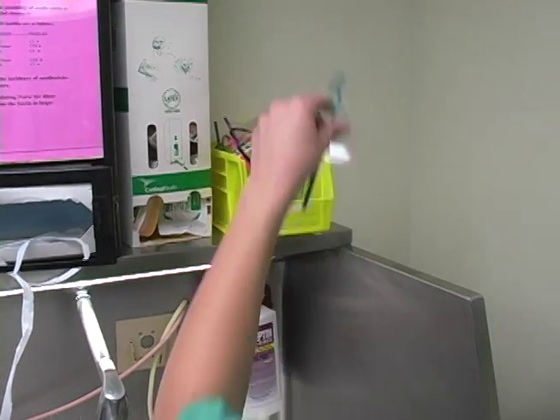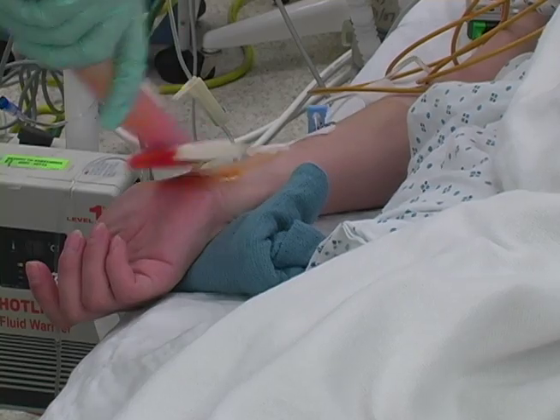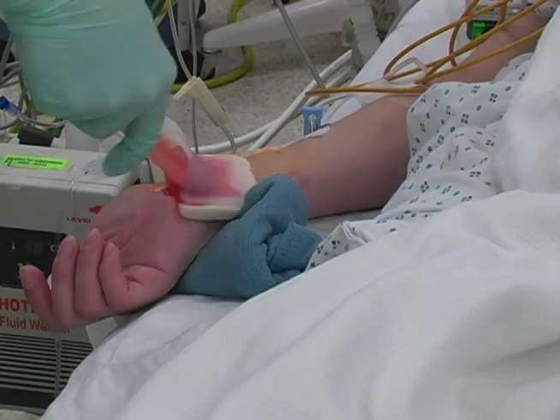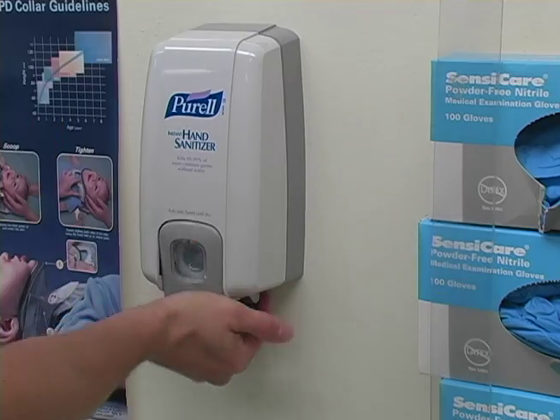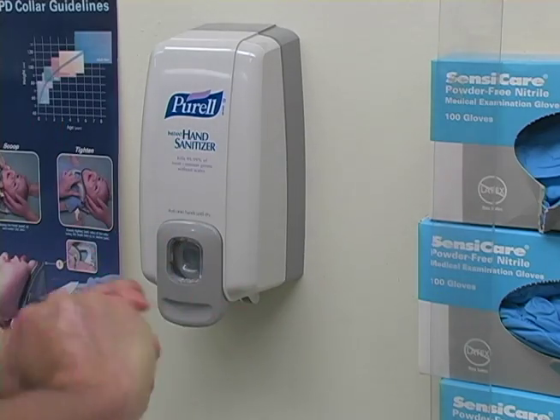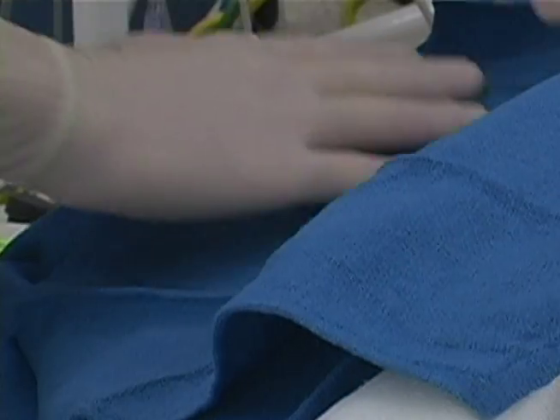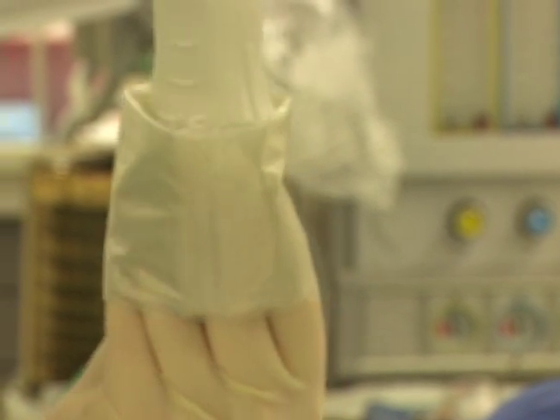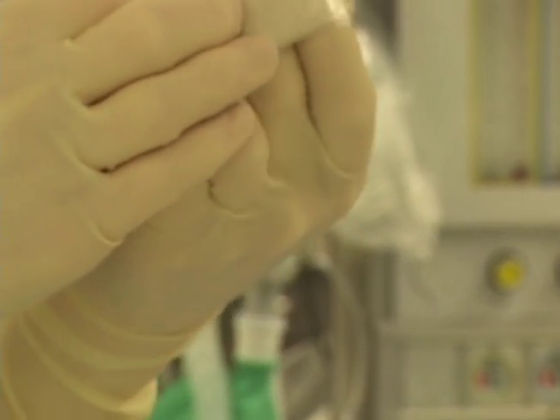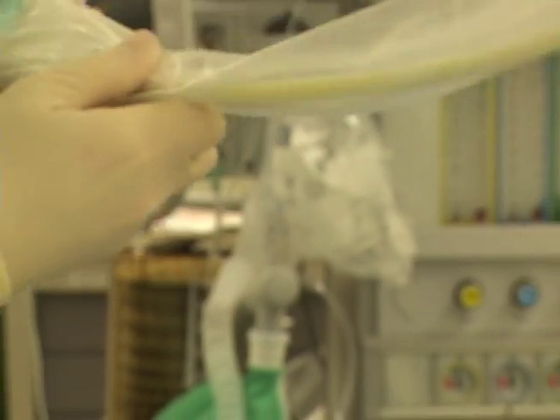Safety glasses are worn to reduce the risk of splash to the clinician. Dyed chlorhexidine skin prep is applied. Jewelry is removed from the operator's hands and alcohol rinse is applied, even when sterile gloves are worn. Sterile drapes are placed around the puncture site, and a sterile probe cover is placed over the ultrasound transducer with sterile transmission gel applied to the patient's wrist.